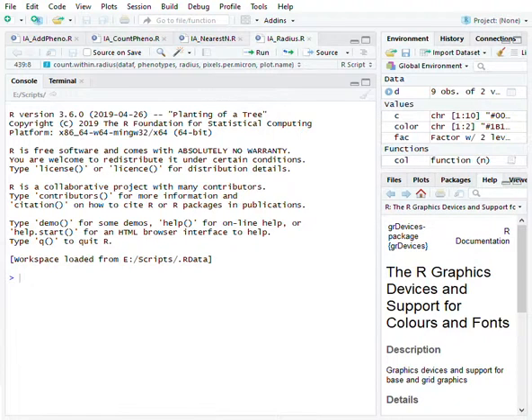pertinent information. Something to note is that for the opal colors, since some of them in our libraries have the entire lot number in the actual name of the color, you'll need to copy that whole name into there, not just the color itself. So keep that in mind.